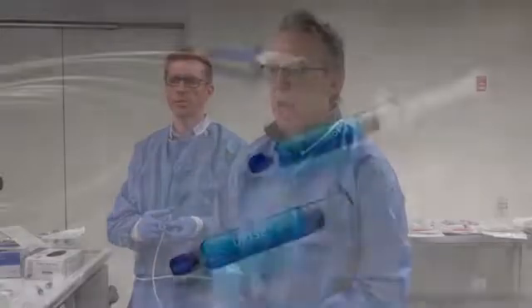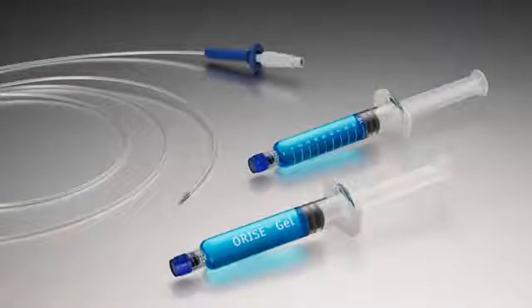Now, I'd like to demonstrate and talk about the value of using a viscous submucosal injection fluid. In this case, we're going to use the Orise Gel. A lot of people in the community are still using saline, and the disadvantage of saline is that, first of all, it tends to diffuse laterally in the submucosa and in the proximal and distal anatomic directions, and ends up giving us a fairly broad, flat mound.